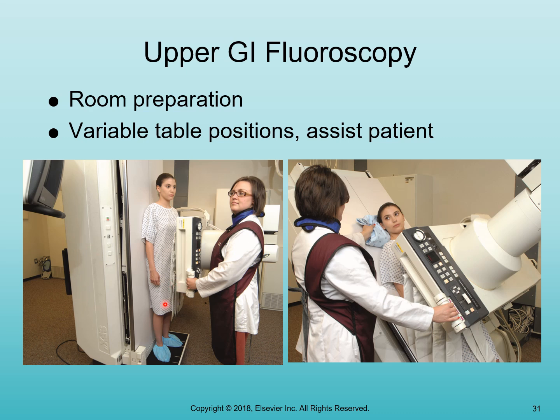These are the lead drapes that fall down, but unfortunately when the fluoro table is in this orientation, meaning it's vertical, those lead drapes tend to fall this way versus this way. But notice the fluoroscopist is attempting to stand closer this way and not out this way, because remember, scatter is created in the patient and then it can scatter at any angle.